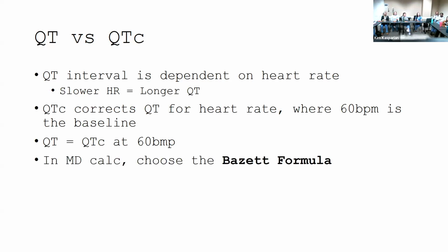Now, there are going to be situations where you should calculate the QTC yourself. We'll talk about that a little bit, but go into MD Calc. You're going to have like 7 options for formulas for calculating the QTC. Choose Bazett. And the reason is that's what my wife told me you should choose. So that's good enough for me.